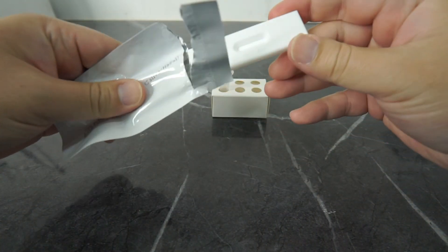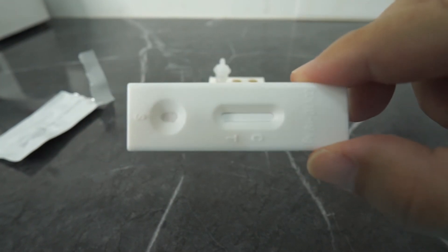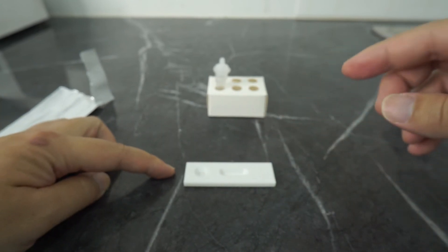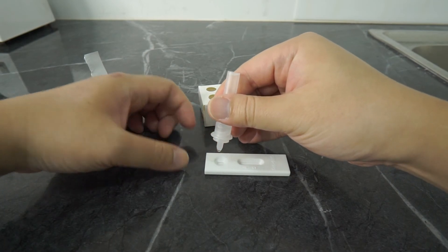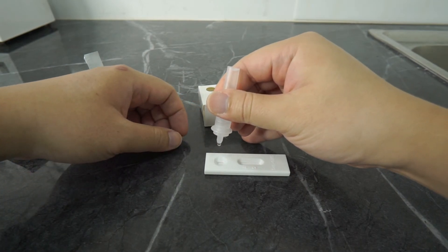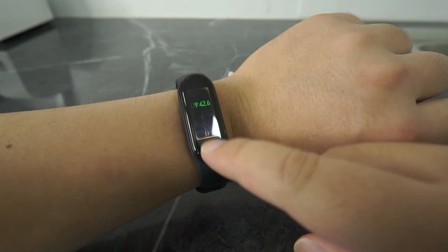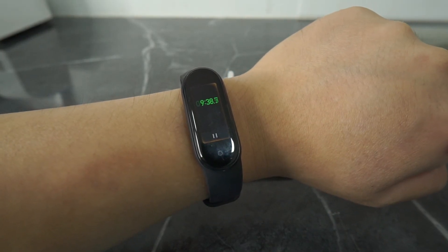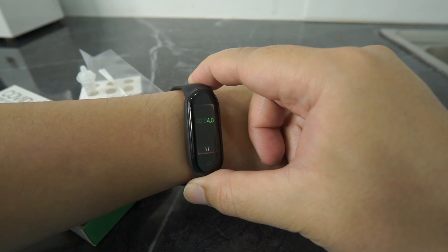Now let's start the test. Gently tear open the pouch and remove the test cassette. Lay the cassette on a clean flat work surface. Label the test cassette with the sample name if you are doing the test for more than one person. Add two drops of the sample solution to the sample well — make sure there are no air bubbles. The sample will start wicking up the membrane slowly. Read the results within 10 to 15 minutes and do not interpret results after 15 minutes, as not following this procedure can lead to inaccurate results.